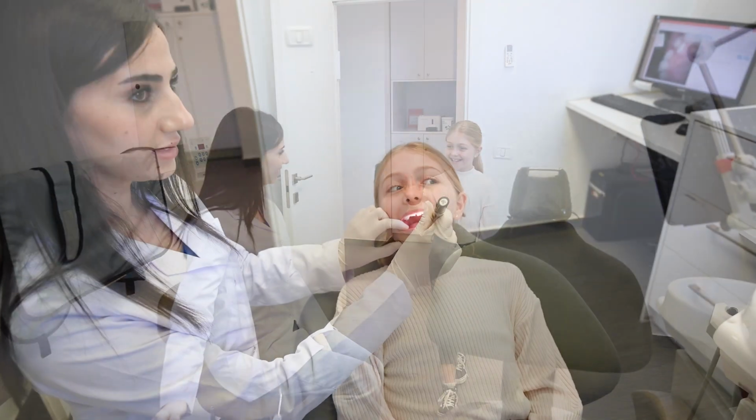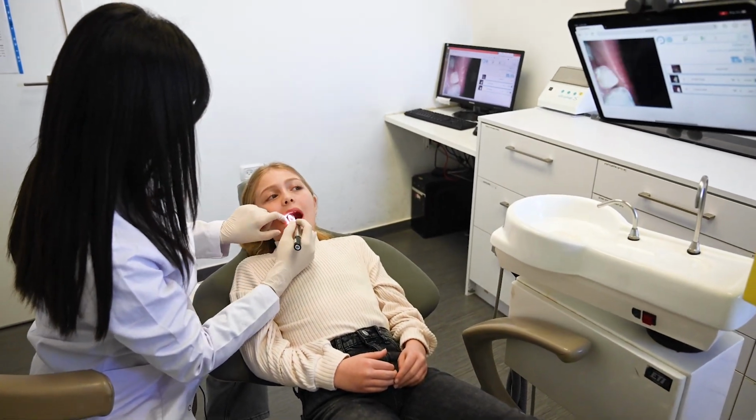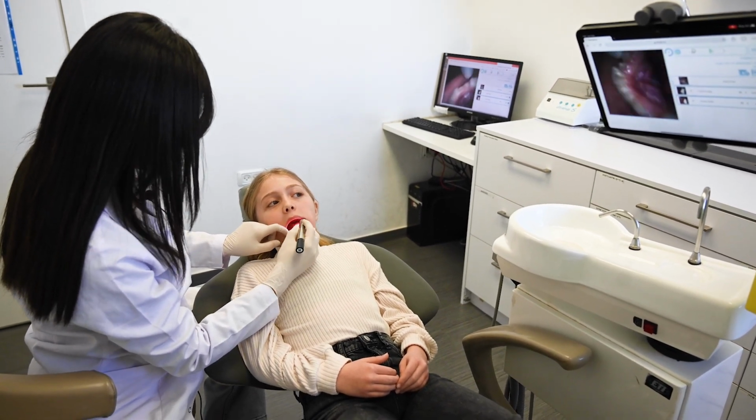Hi, today I'm going to show you how the SmartMirror system allows the doctor to document treatments while working by using the MIRI language. In the following tutorial, we will learn how to take an image and record a video.